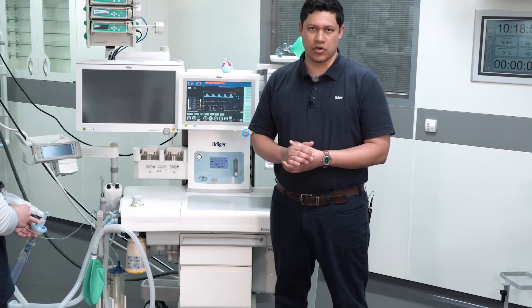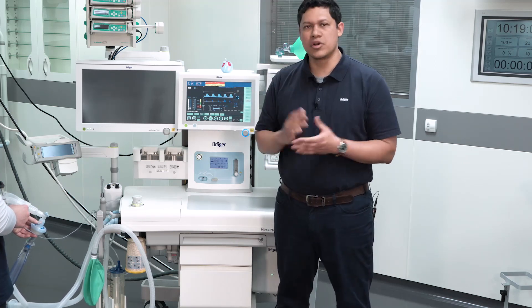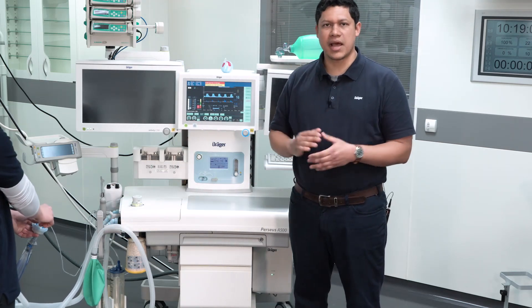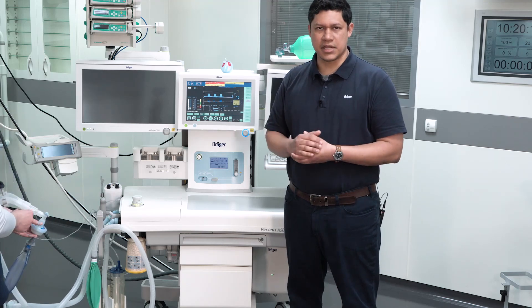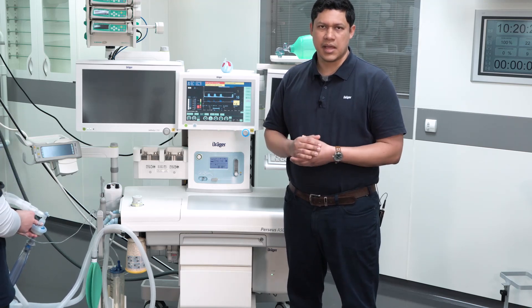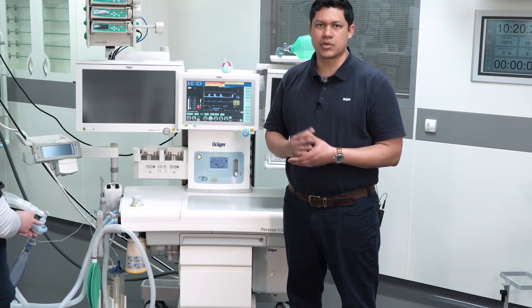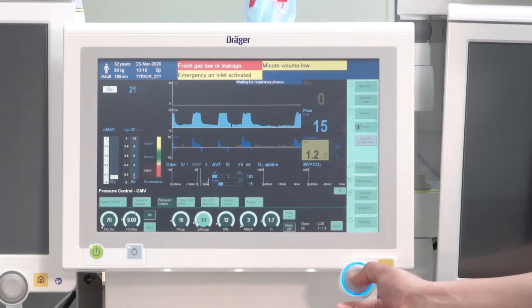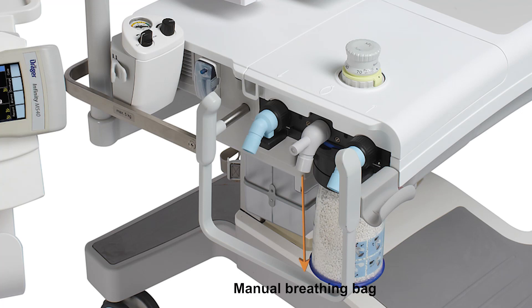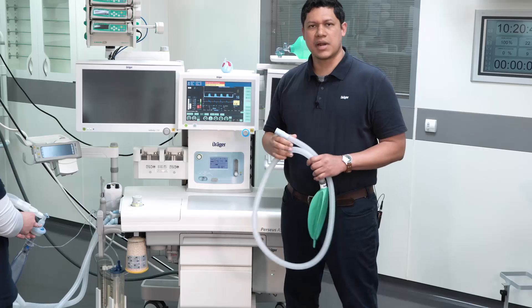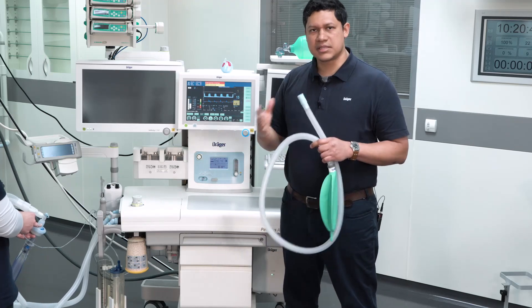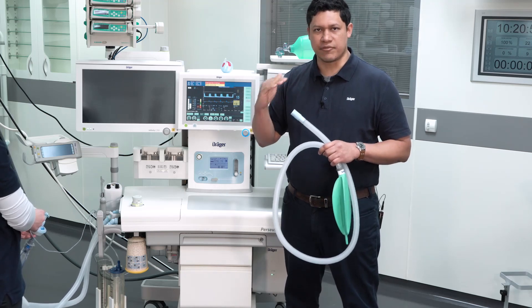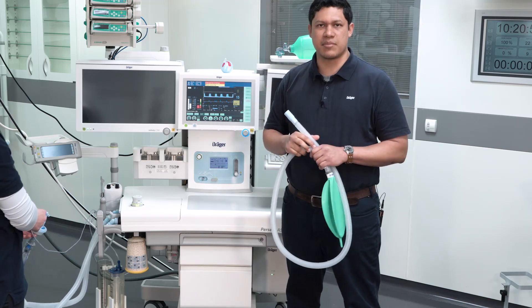In the case of fresh gas flow deficit or a big leakage, you will notice that the manual breathing bag gets emptied. You should act immediately. To secure mechanical ventilation of the patient, you can follow the next steps: identify and correct the leakages, and increase the fresh gas flow. Additionally, you can detach the manual breathing bag from the system. This will allow ambient air to enter the system. In this case, be aware that the inspired fraction of oxygen will be between the set percentage of oxygen in the fresh gas flow and 21% oxygen from the ambient air.